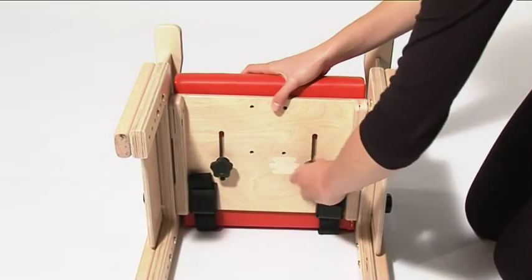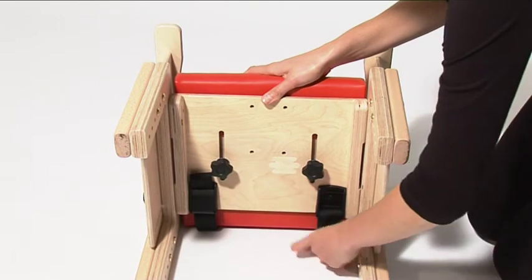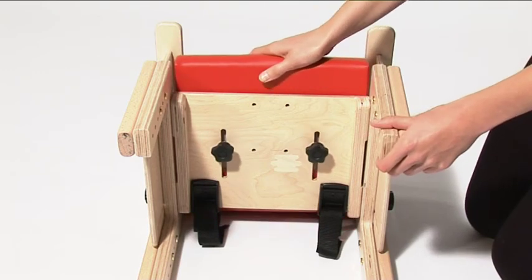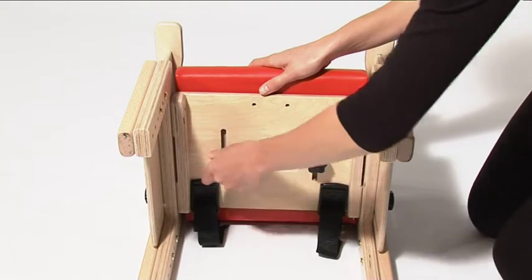To adjust the depth of the seat, loosen the hand wheels and remove the straps. Slide the seat to the desired position. Tighten the hand wheels when the seat depth is set to the desired position. Then replace the straps.